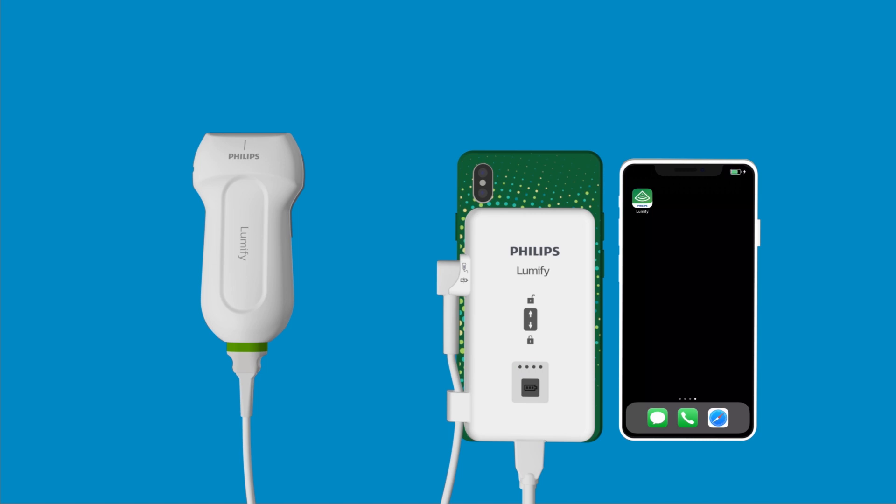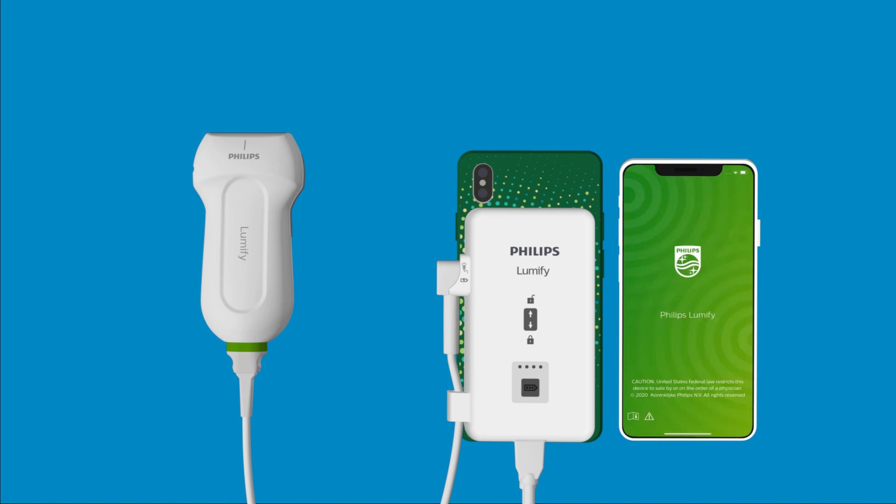You should then be prompted with a message on your device. Click Allow to auto-launch the Lumify app. You can now register your transducer and begin scanning with your Lumify iOS ultrasound system.